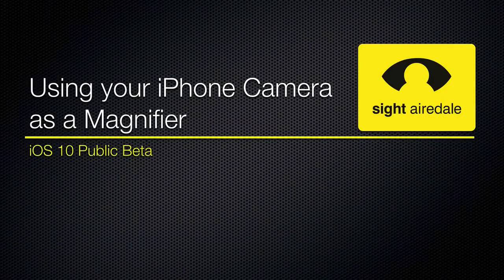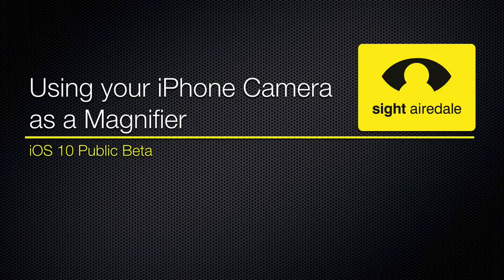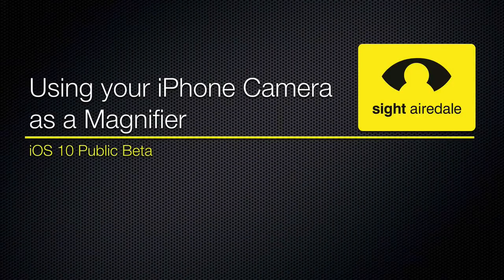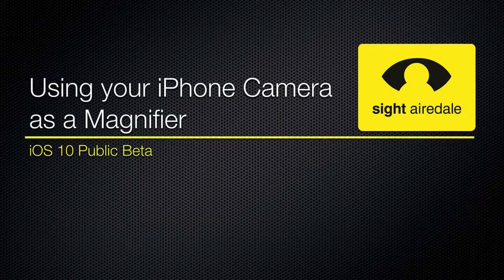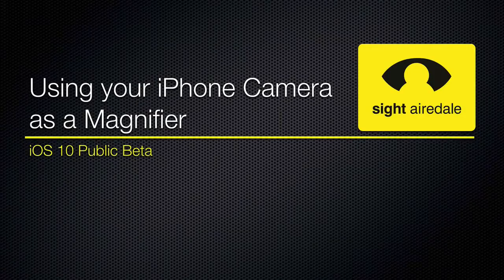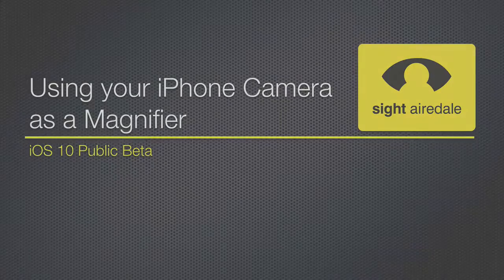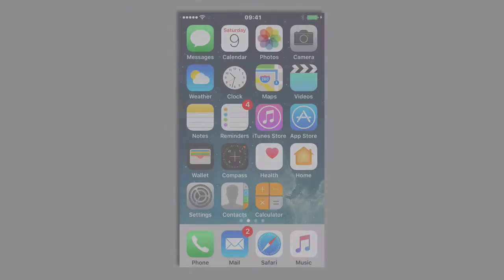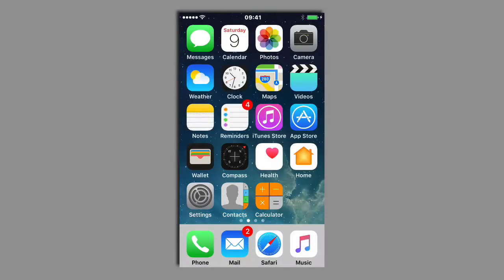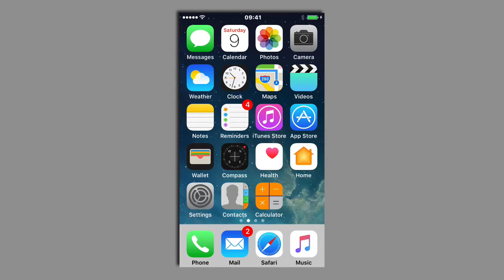Using your iPhone camera as a magnifier: accessibility features in the iOS 10 public beta. Hello and welcome to this video looking at some of the new accessibility features in iOS 10.